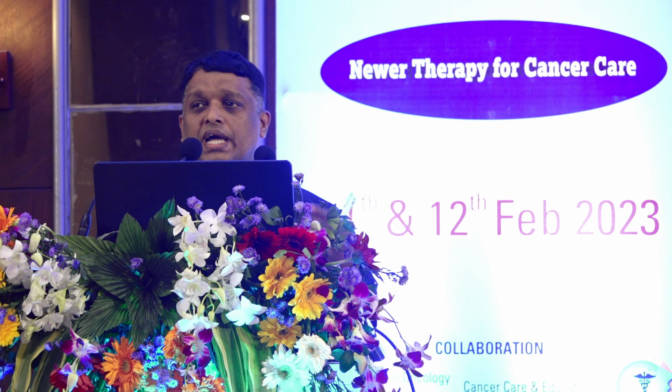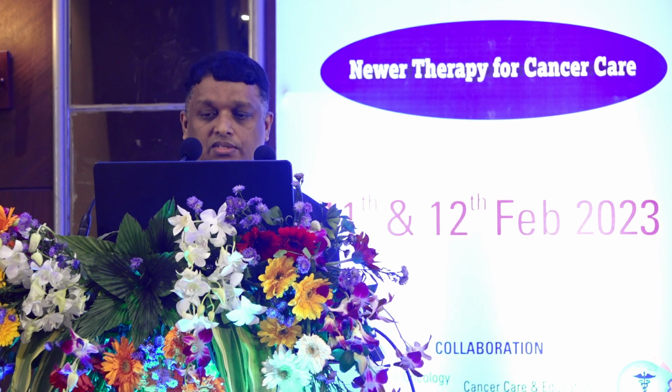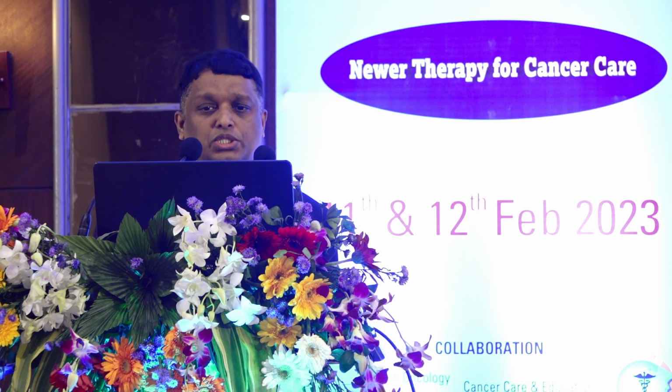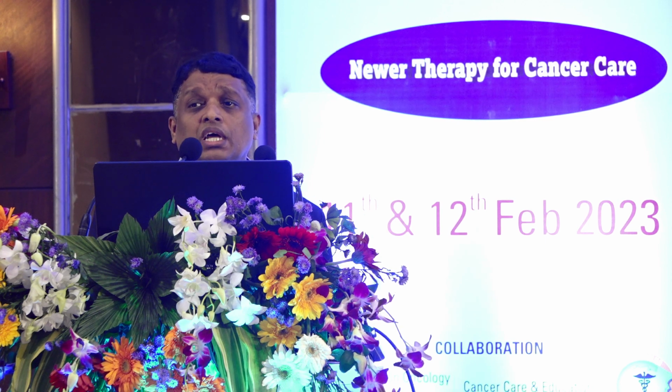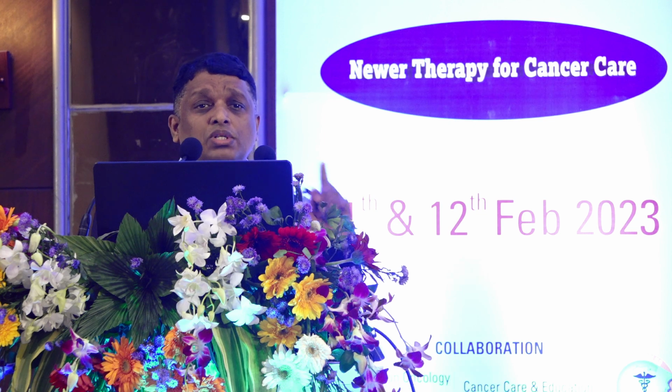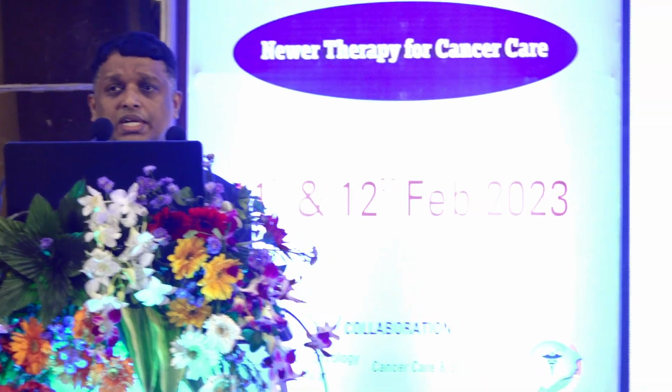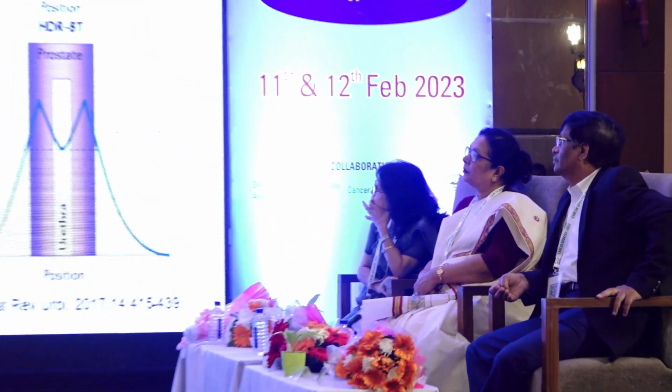And we all know that the higher the dose, the better the results in prostate cancer. There is a higher biochemical control rate when we increase the dose in prostate cancer. A lot of studies address this issue. And brachytherapy is the best way of dose escalation. You can see the dose that we can achieve around the needles, 150, 200%, that cannot be achieved by any form of radiation as of now. And at the same time, what is more important is that when you do brachytherapy, the dose to the urethra is kept low. Not only the urethra, the surrounding structures like the bladder and rectum are also kept low when you are escalating the dose to the prostate.